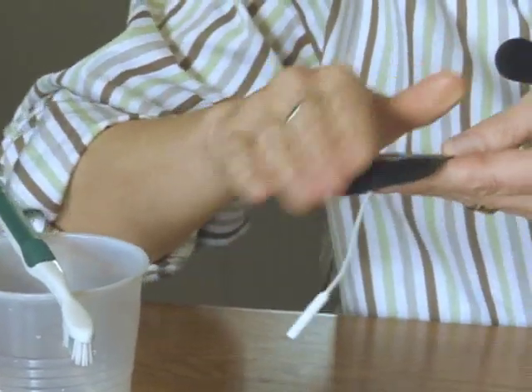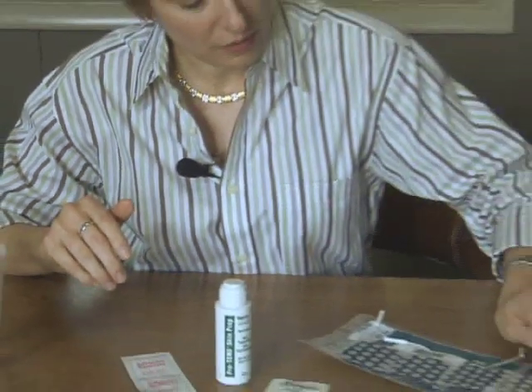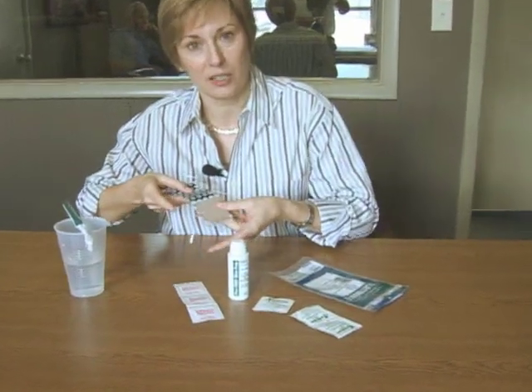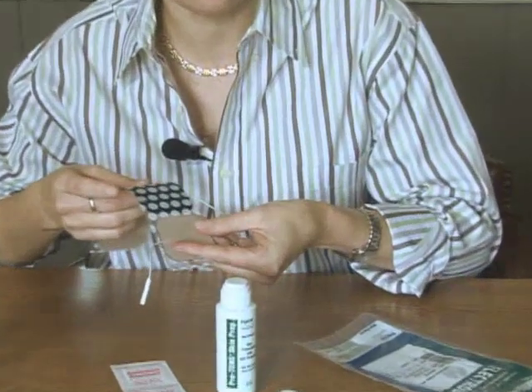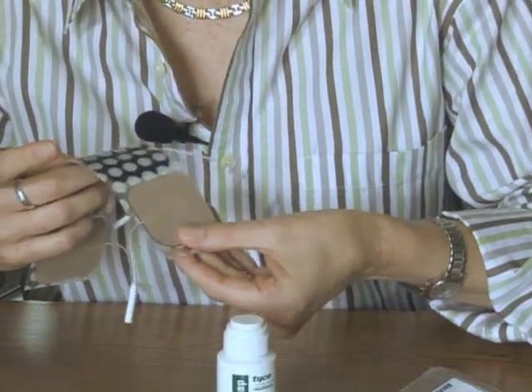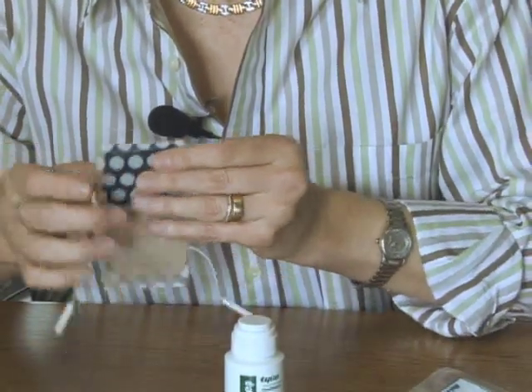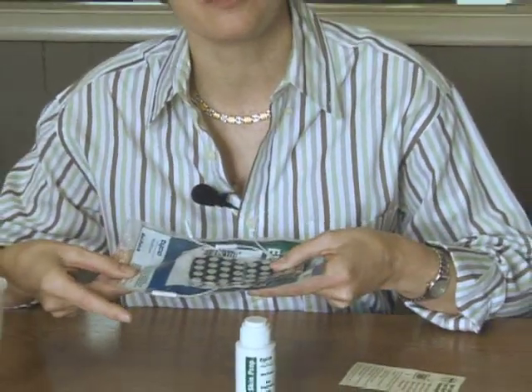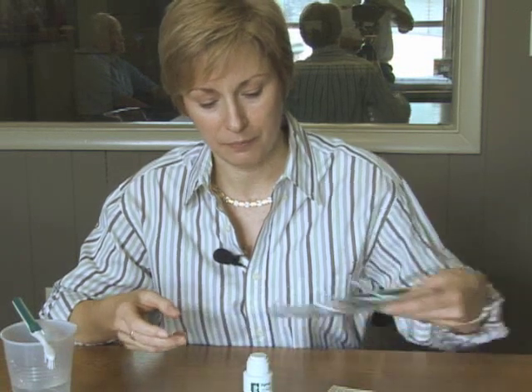You would then, you don't want to have it soaking wet, but replace it right back onto the plastic card for use another time. They'll last much longer if you keep them right on that plastic card. And then you could put them back into your package and place them in the refrigerator. Keeping them cool will allow them to last longer and have just the right amount of humidity to them.